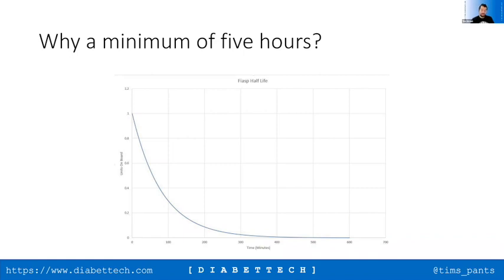But in order to identify how much beyond 5 hours you need to be, you do tend to need to look through your data and just see what's going on. And a lot of people figure out that actually that 5 hour point is too early for them and they need to move it out. It's not a very easy thing to identify. And generally what will end up happening is that you'll get a bit of instability. And if you push out that DIA by half an hour each time, it will reduce the instability. That tends to be what you see happening. What I would mention here is that if you are unsure about the right value for you, it's definitely safer to have this value higher than lower. Yes. Yeah, absolutely.